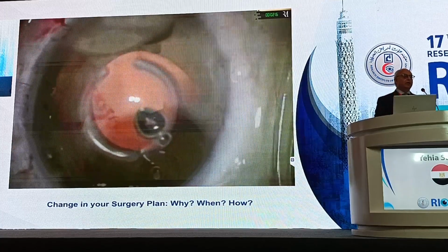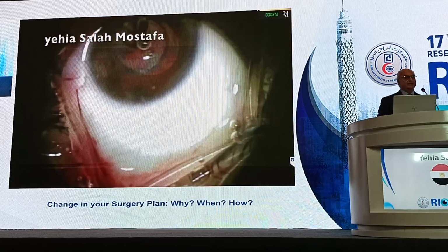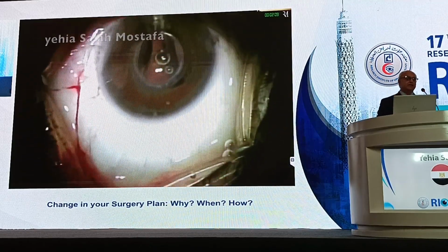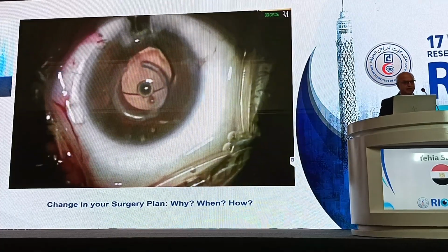Then I will implant the lens. This is a hydrophobic acrylic lens, implanting it in the bag. This is a 13 millimeter overall diameter hydrophobic acrylic lens.